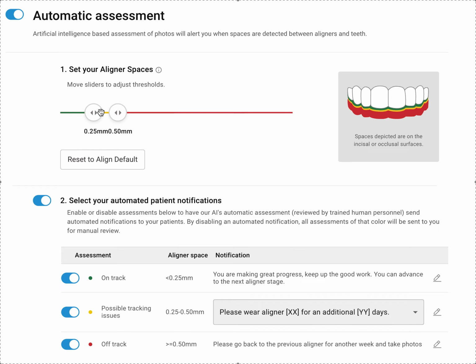Nobody has created something cool yet, but I find this stuff on Etsy. You can have it made. And if you've got crafty people with a Cricut, you can label it. I mean, I've done some demo videos on that. That's pretty much it. Patient does the app, you do the app.